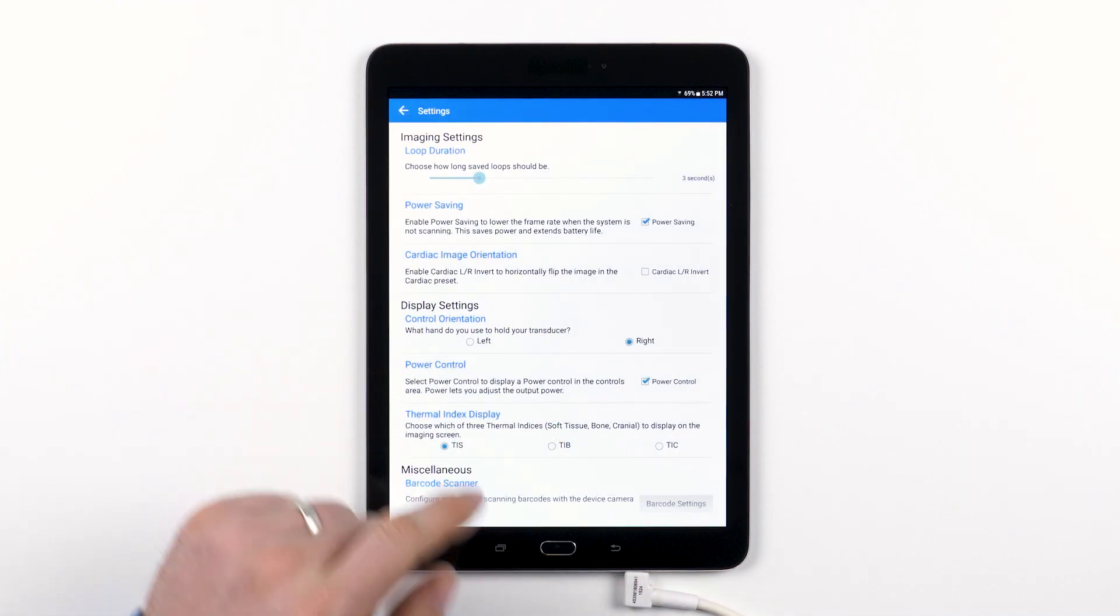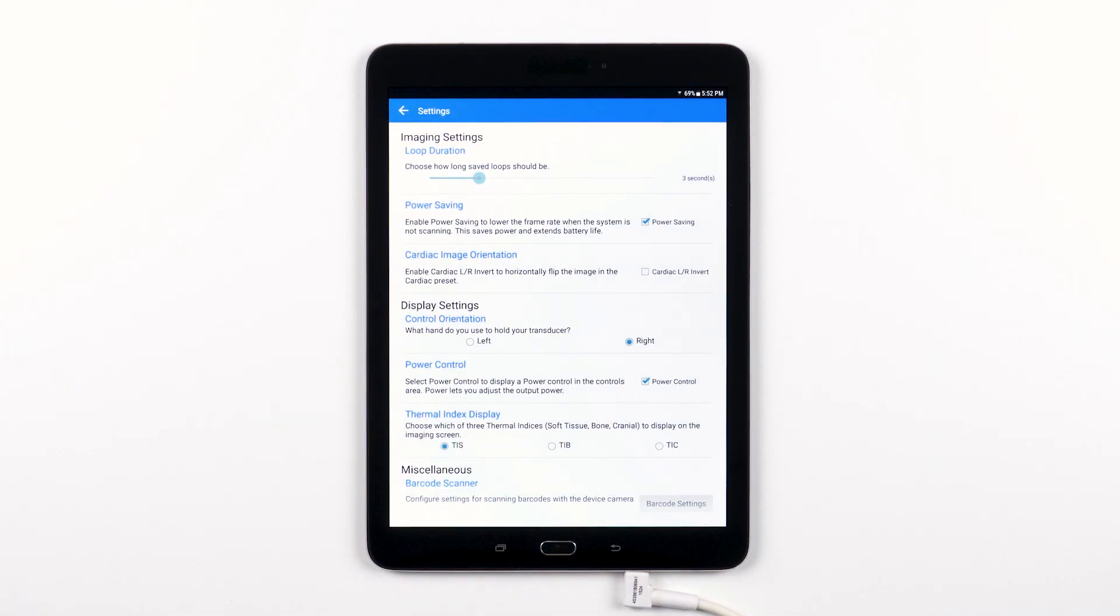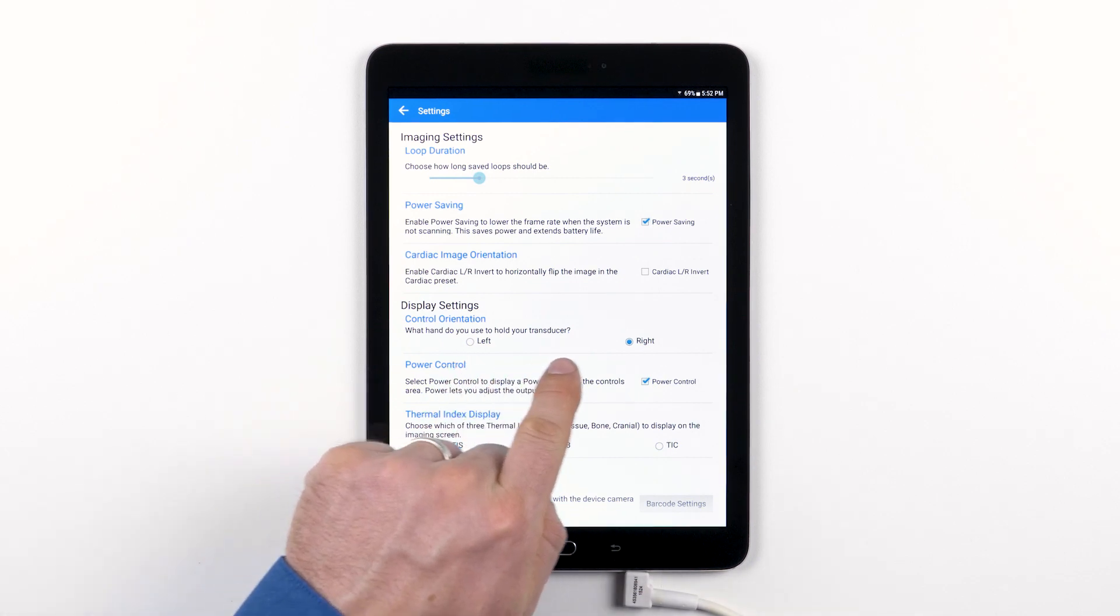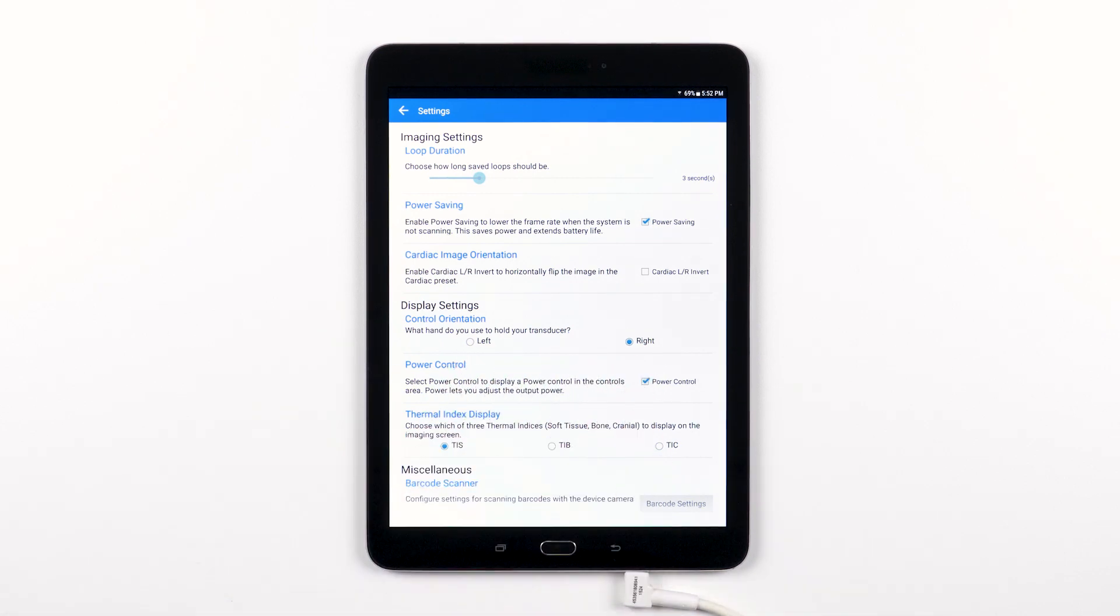The control orientation setting allows you to orient the system controls based on which hand you use to hold the transducer.